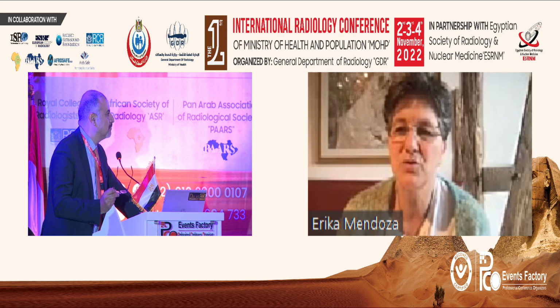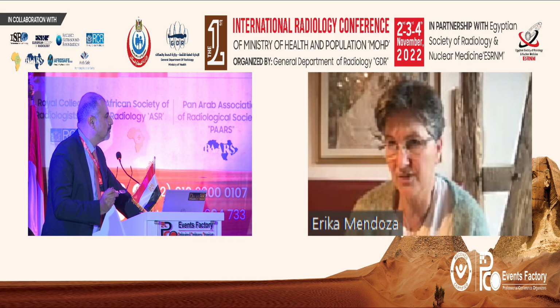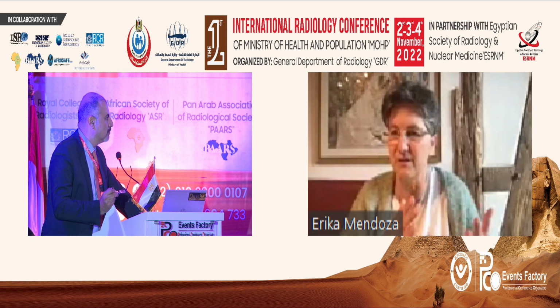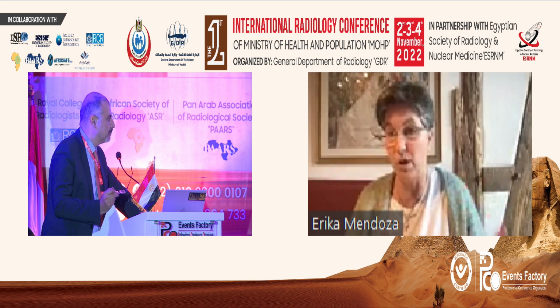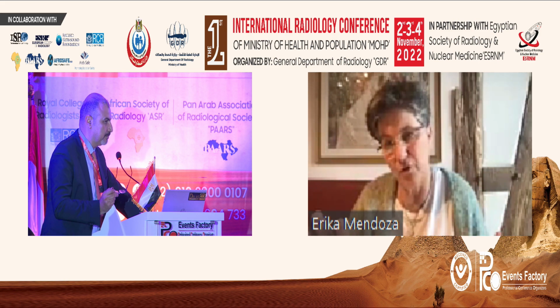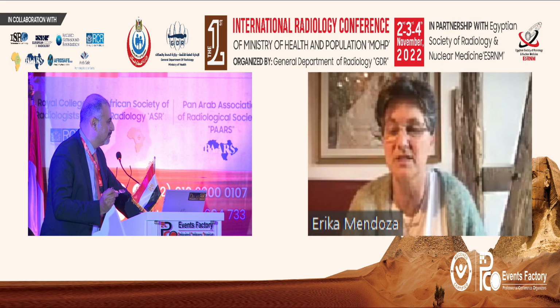Yes, there you have two situations. Sometimes the surgery was just not good, we have to say it like this. I differentiate whether there is a stump with valves. If after surgery or stripping, for example, there is a stump with valves inside, they didn't go to the deep vein. So you have to redo the crossectomy, or I often foam them because it is easier for the patient and they're not recutting in all these scars.